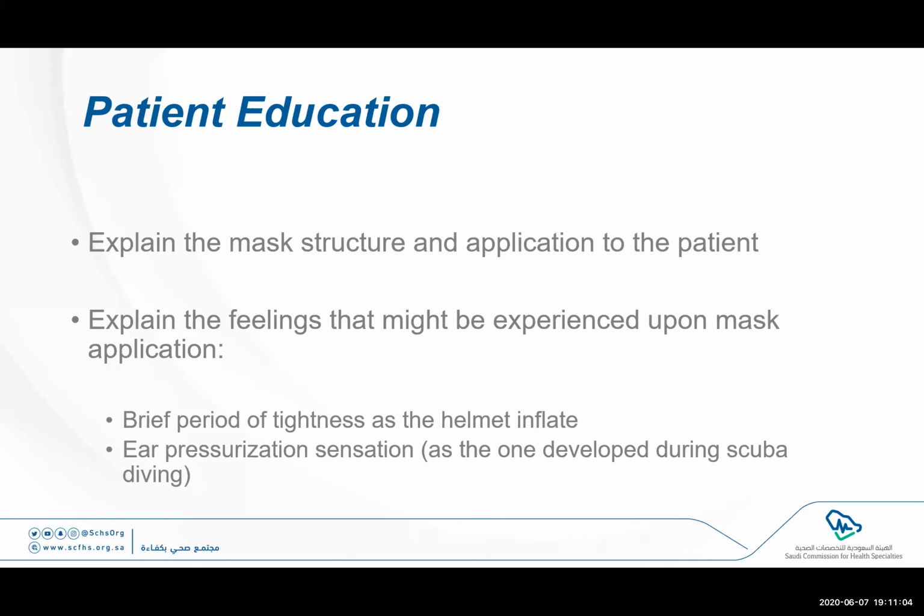So you decided that your patient is a candidate, and you are proceeding with the helmet application. The first step should be patient education. This concept is very new to most of our patients, and that's why the helmet has to be explained to the patient. How does it work? How is it applied? And how is it removed? And how the patient is going to be sustained on the helmet.